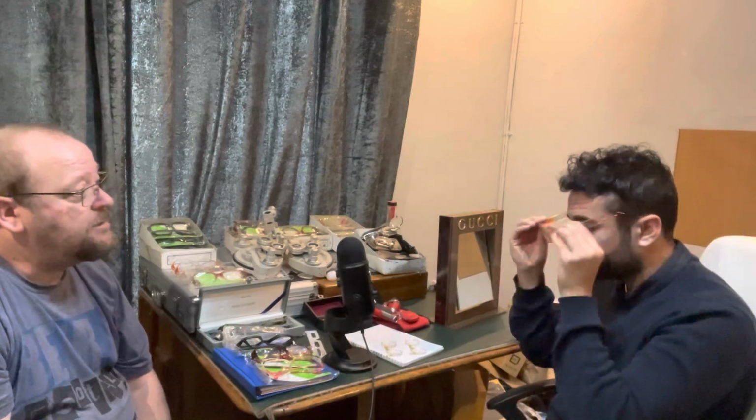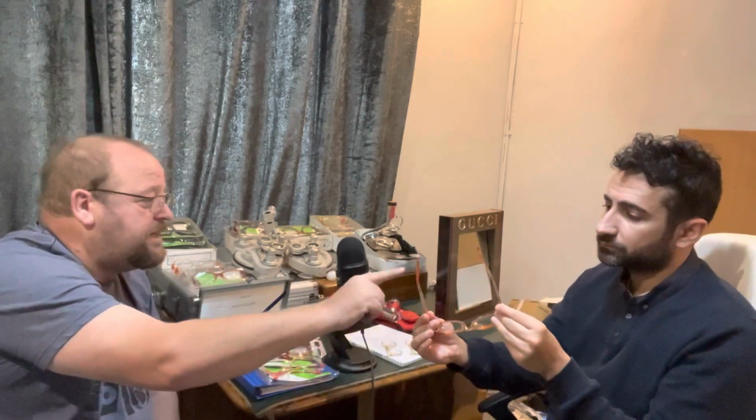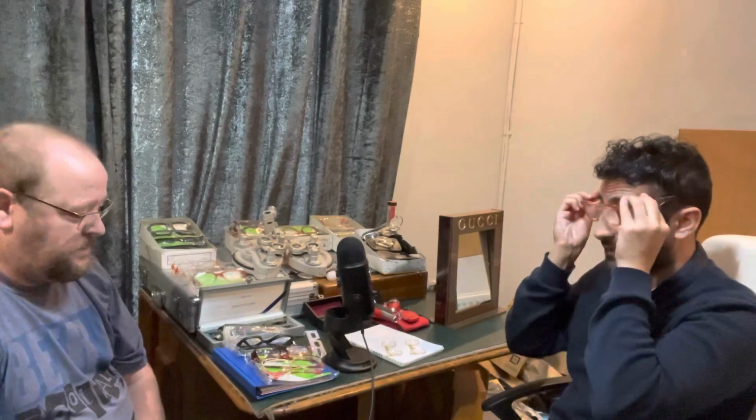And have you noticed the shape of the side? This part here? But going further back, that's called a swan neck design. Can you see how? This part? Yeah, it's called a swan neck design, and it's designed that even before we start to curve it, that already tucks around the ear. So it's aiming for a good fit from the get-go. Yeah. It works, doesn't it? Yeah.